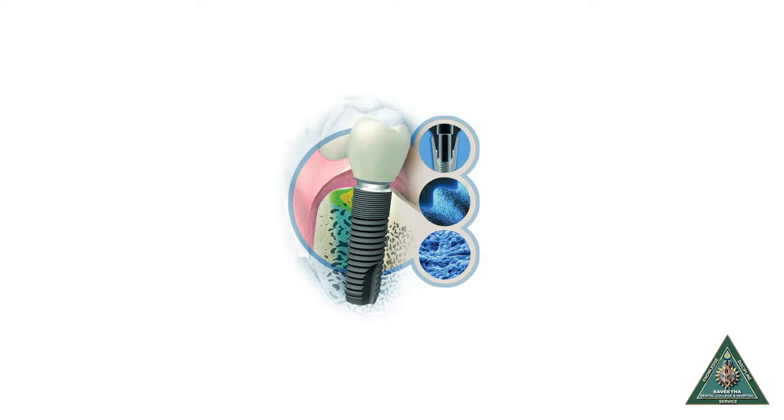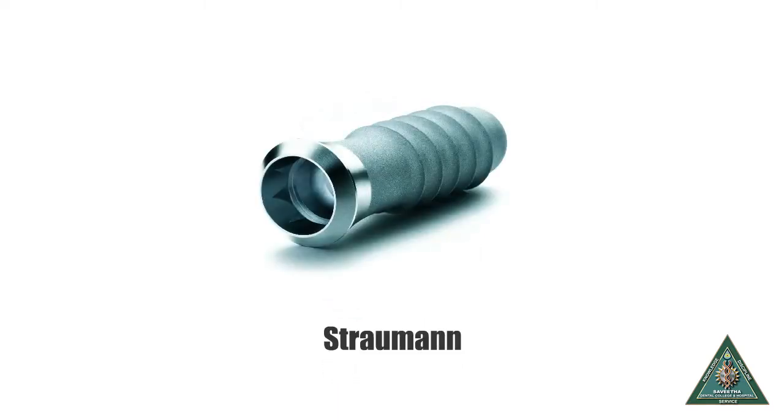The etching process is used to create surface roughness. Companies using this process include AstraTech, where they use hydrofluoric acid for their OsseoSpeed surface. Straumann is the biggest implant company, where they use sulfuric acid for their SLA active surface. Some studies show that using hydrofluoric acid does help in better osseointegration, as fluoride helps in bone formation.